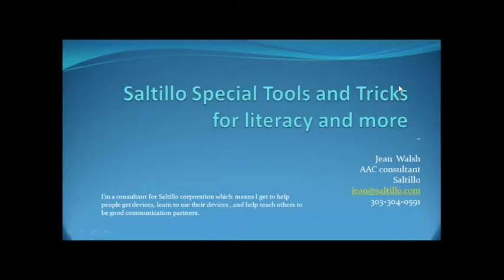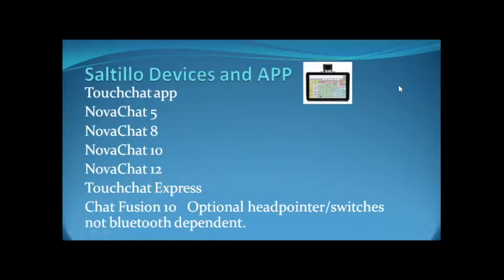Okay, let's get going. As far as Saltillo, I just want to talk to you briefly about what our company is as far as communication devices. We have the NovaChats, and we have one app, the Touch Chat app. The NovaChats are all the same on the inside. They just are different sizes. So the 5 is like a phone, and then the 8, 10, 12.